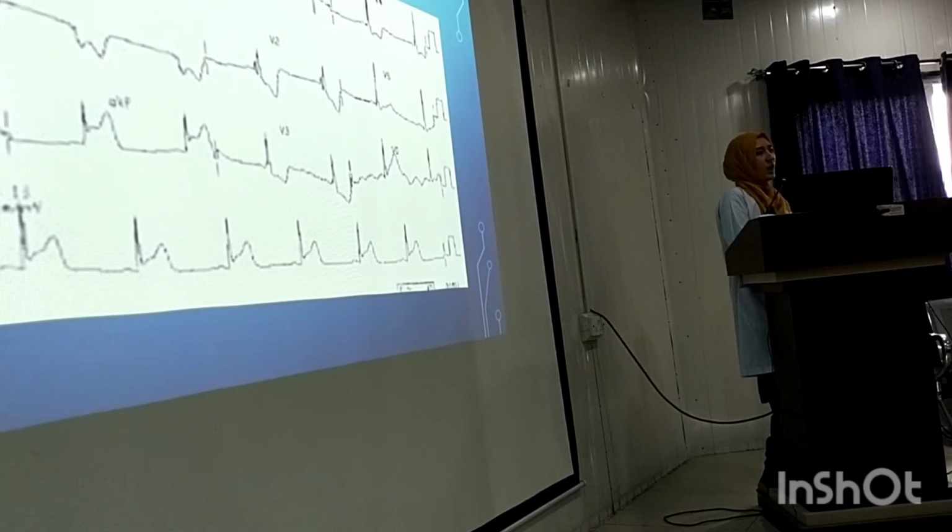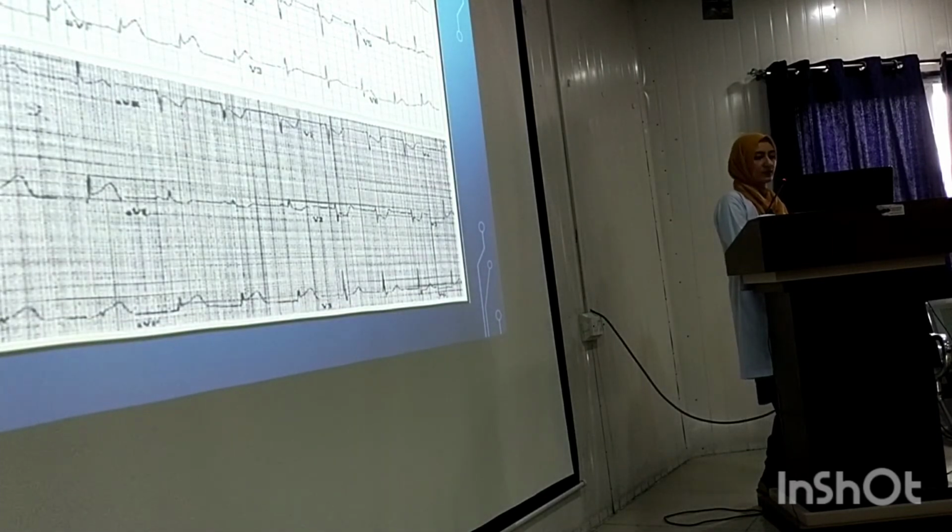They have no value. Alone in an ECG, changes in any single lead, unless we are talking about the rhythm, are useless and meaningless; we don't give any value to them. So for changes in the inferior leads, we have to take lead 2, lead 3, AVF cumulatively. Similarly, if we are labeling it as an anterior wall MI, the changes should be there in V1, V2, V3, V4, at least in these 4 leads. And if we are talking about a lateral wall MI, lead 1, AVL and V5, V6. Only if the changes are cumulative do we give them value; alone, they have no importance.